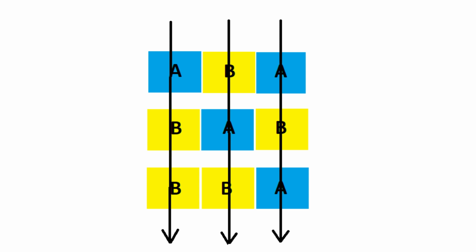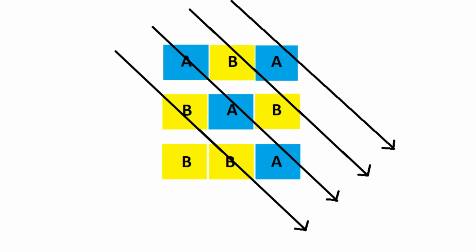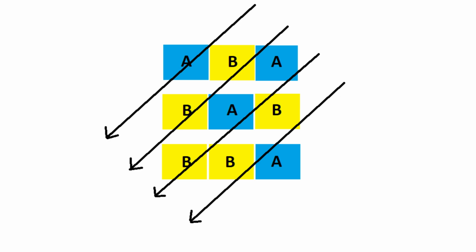Since we know the absorption percentage of each object, we can compute what the final output would be when light reaches the detector. Now let's cast the radiation from different angles. Each time the detected radiation would be different. So unlike in the case of X-ray imaging, we won't be getting a shadow of the object, but we will get a lot of data about the penetrated X-rays.